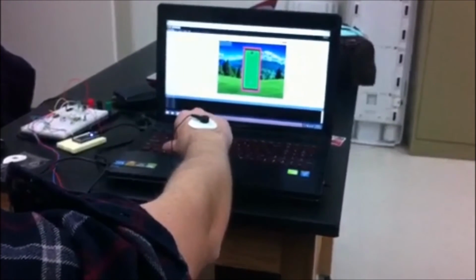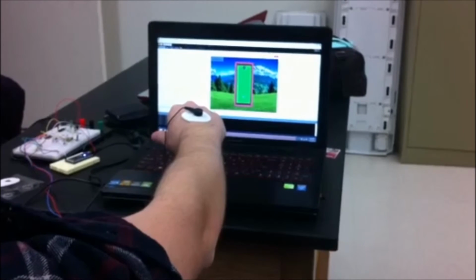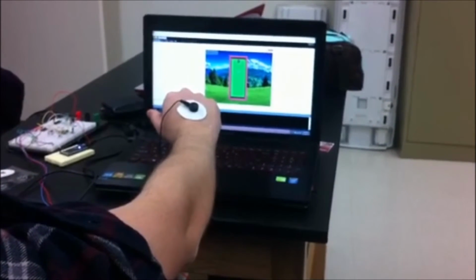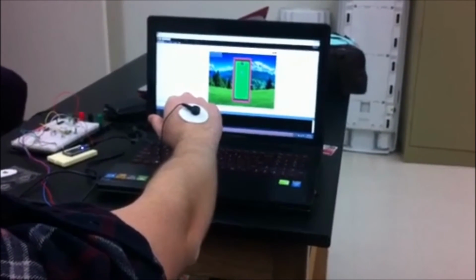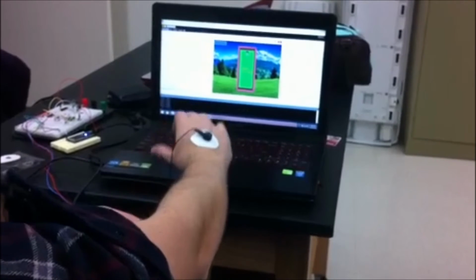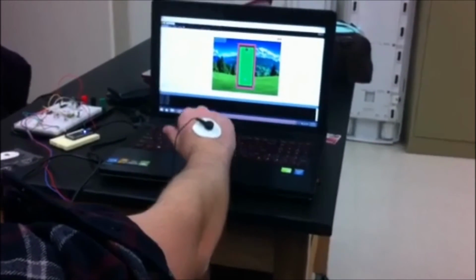And if you can see the ball in the bottom portion of it, when I flex my forearms, I'm going to move my hand down. The ball moves, and then it slows down. So now I can try it again. And I made it. So now I'm going to do this one more time, just to show you.